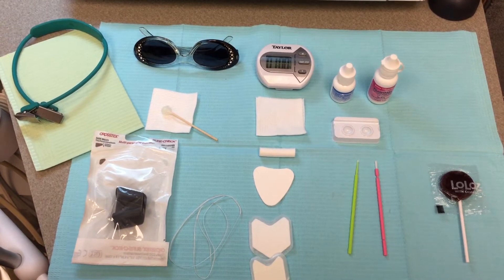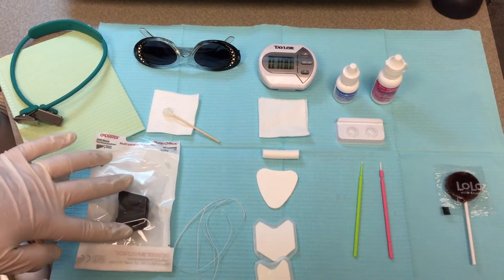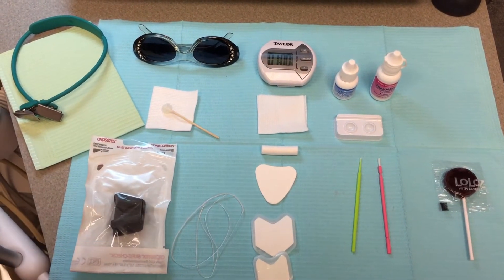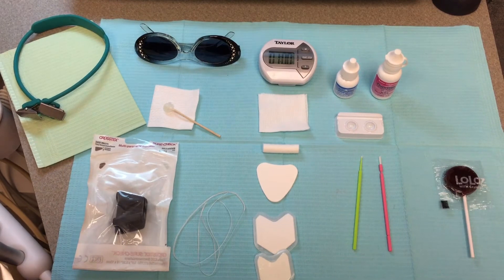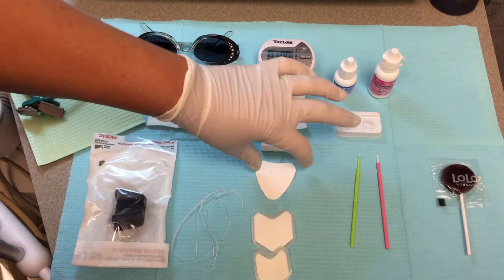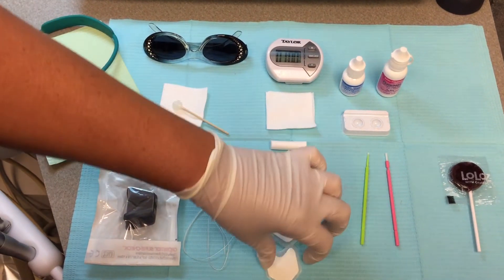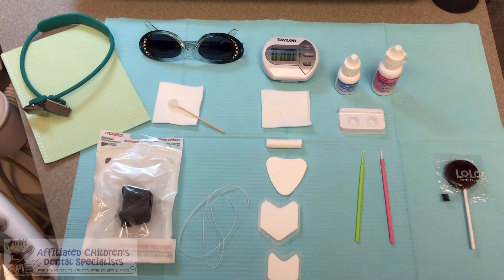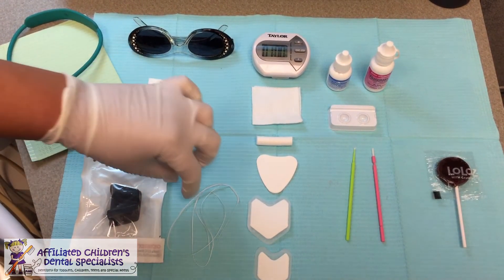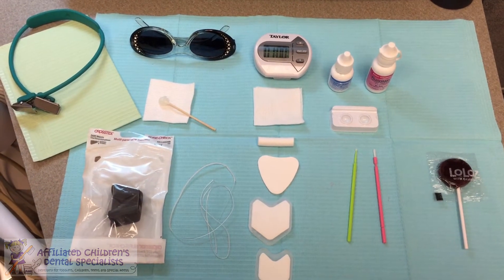Now we're going to isolate the area — you want it to be toothbrush clean. I like to use a bite block if I can, then isolate with a variety of cotton products depending on the area: gauze, cotton roll, little paper dry aids, or absorbent dry aids in a variety of sizes. If I'm going to be doing the interproximal technique, I'll actually use some super floss.